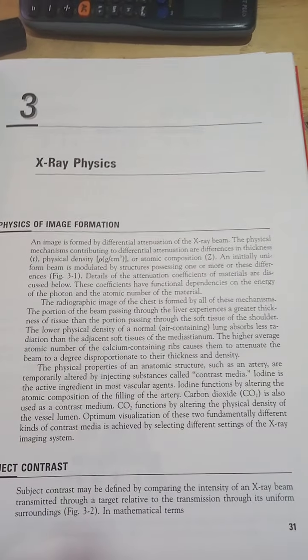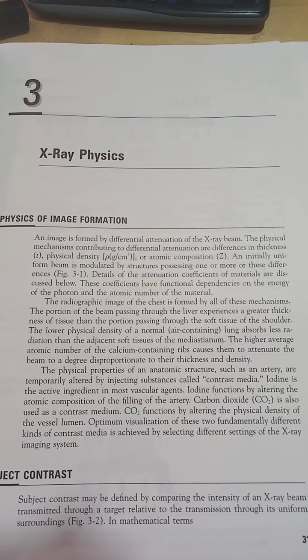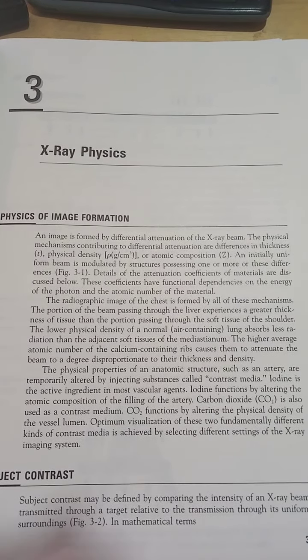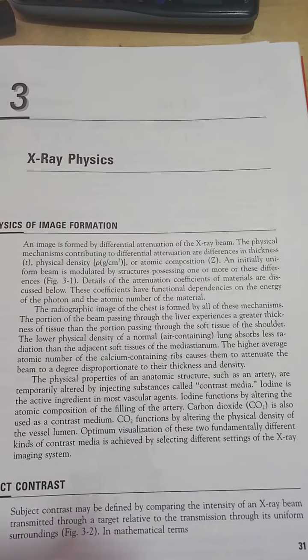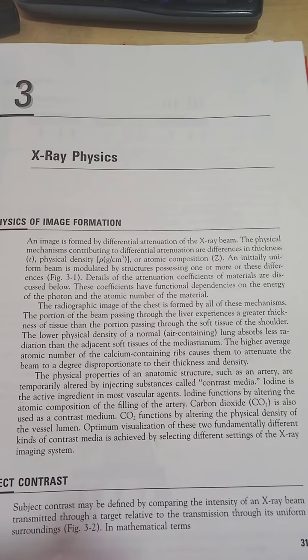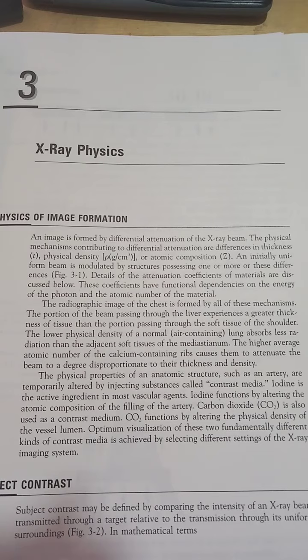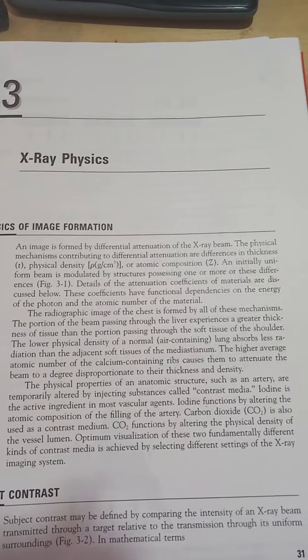So it's very obvious. The radiographic image of the chest is formed by all of these mechanisms. The portion of the beam passing through the liver experiences a great thickness of tissue, i.e. higher opacity, lesser transmittance than the portion passing through the soft tissue of the shoulder, which is fibrous muscular tissue.